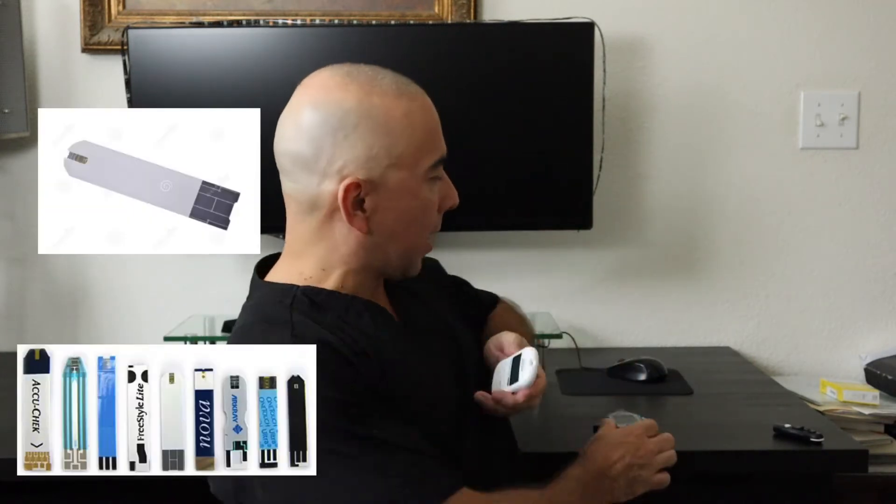These machines require a test strip that actually goes into the machine, and then when you poke your finger, you put the blood onto the test strip. This is a test strip from the Freestyle Lite.